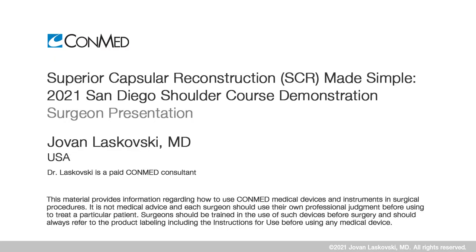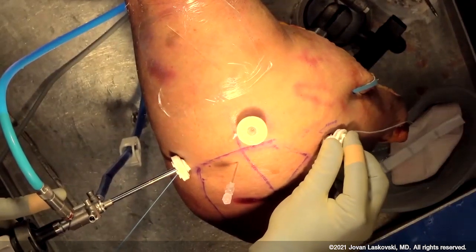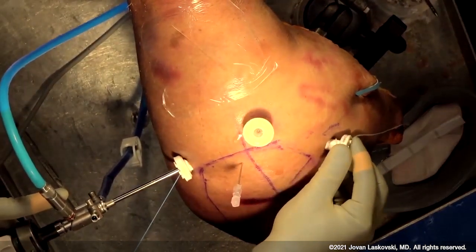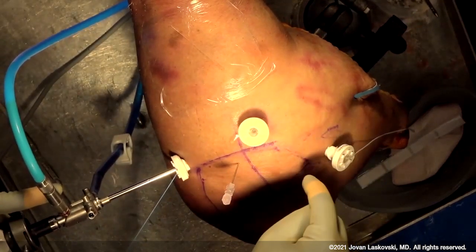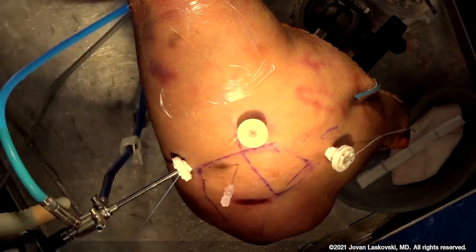We have a pretty straightforward setup. We have an anterior portal established, and this anterior portal is really one of the last portals that I make, because I want this to work double duty for us. Not only will it allow us to place our anterior glenoid anchor, but it'll also aid in suture passage and retrieval as we come back.